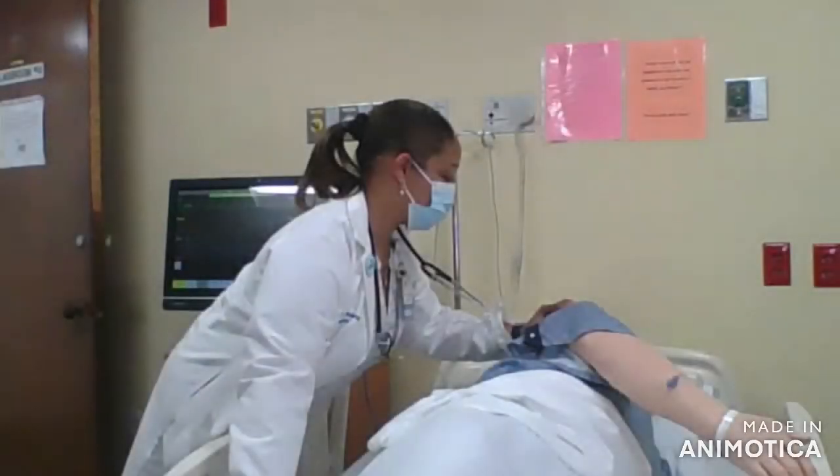As you can see, the nurse turned the patient into the recovery position after administering nasal naloxone and is waiting for the team's arrival. If you have any further questions on this, please refer to the Elucid policy on nasal naloxone administration or ask any of the clinical educators.